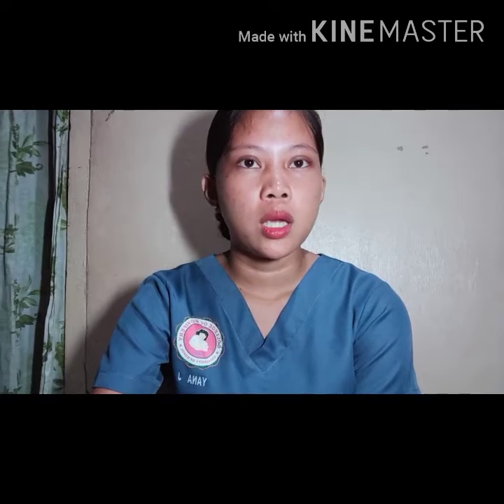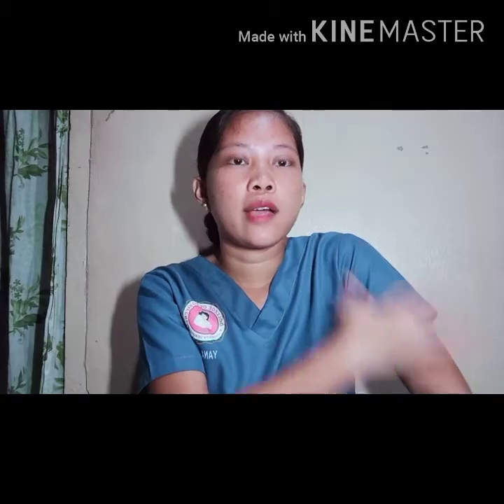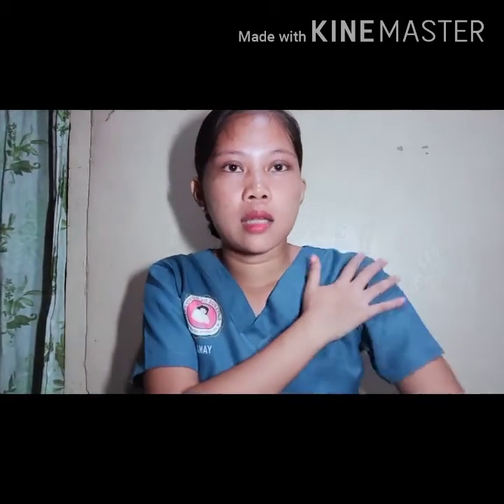If a patient has a condition causing poor vascular return, or mastectomy or stroke, the affected site must be avoided. So if the patient had a stroke and the affected part is the right side, you avoid the side on the right. Okay? If they had a stroke, that side may not function properly.